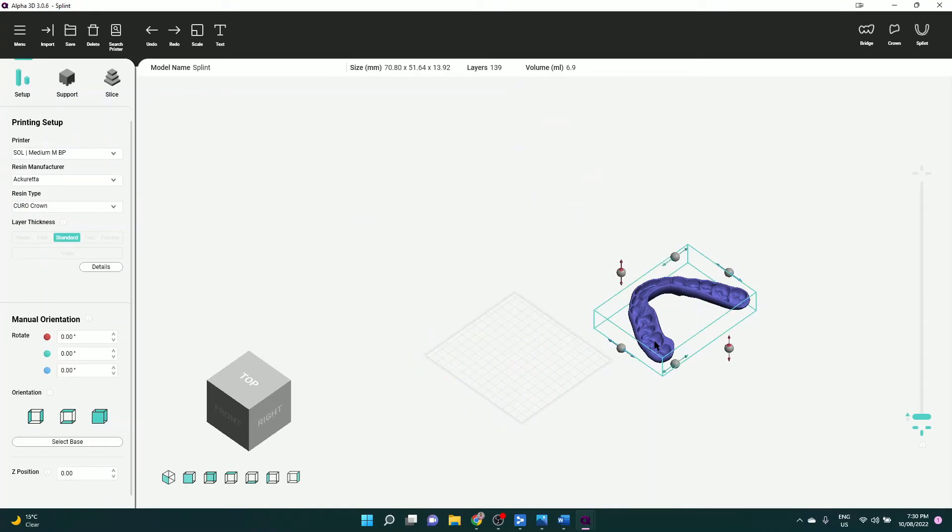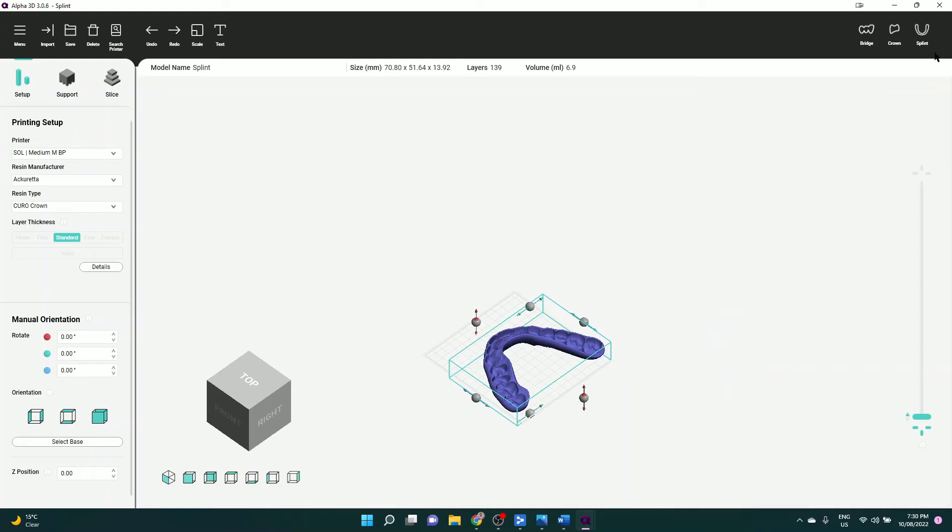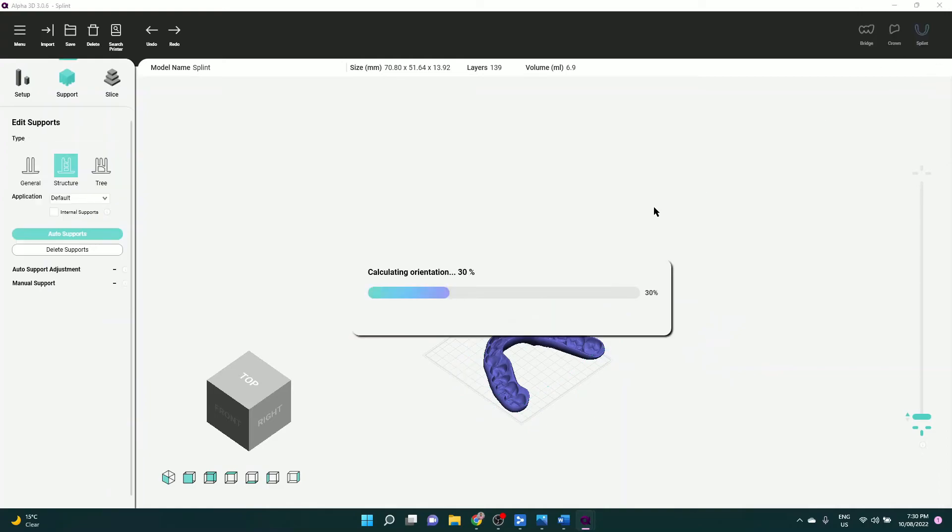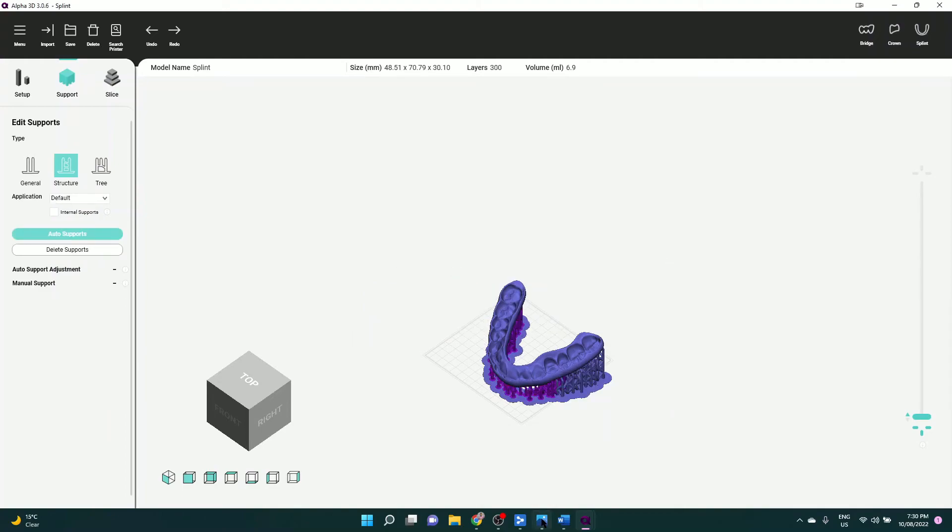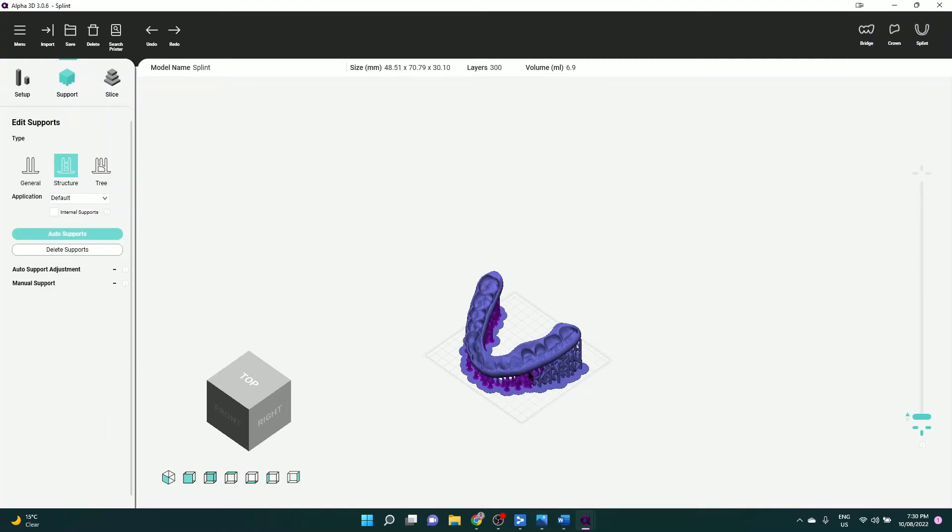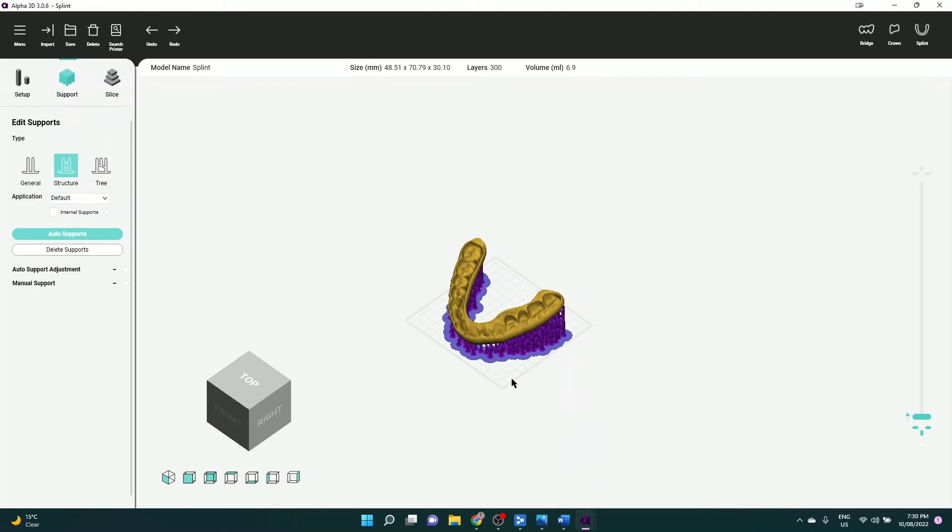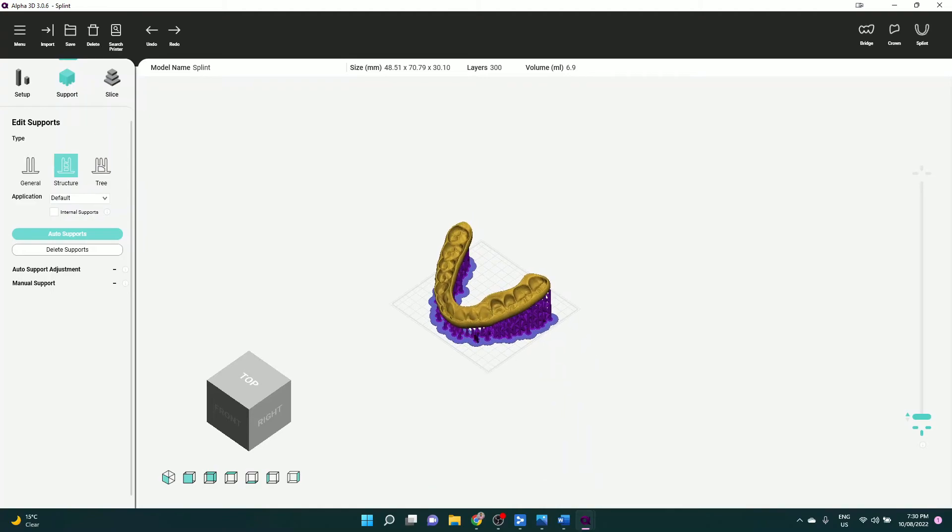This software has built-in AI as well. You click on Splint, it'll generate the supports for you, and away you go. So that's the splint.